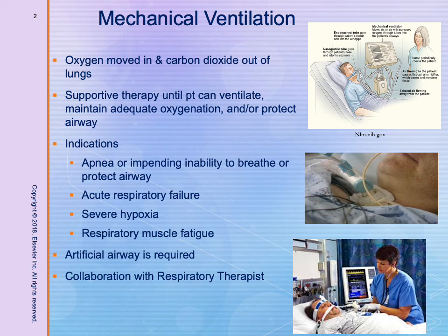Mechanical ventilation is when a machine is used to move oxygen into the lungs and carbon dioxide out of the lungs. It is a life-saving therapy that is used for patients who have an inability to protect their airway or who have an illness that leads to respiratory failure. Mechanical ventilation also provides supportive therapy until a patient can ventilate, maintain adequate oxygenation, and/or protect their airway.